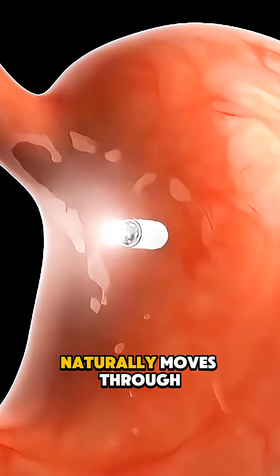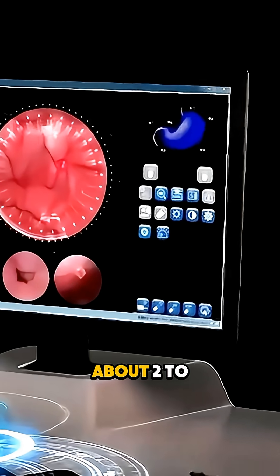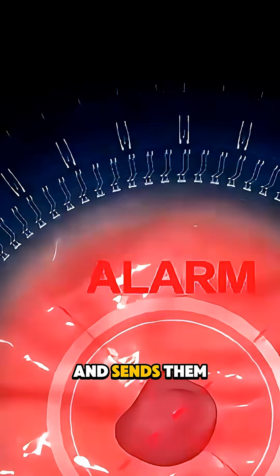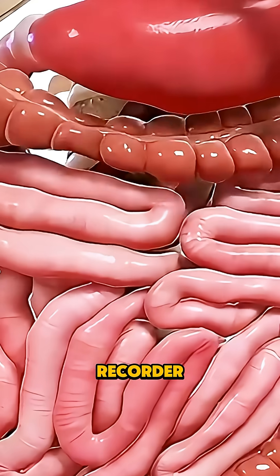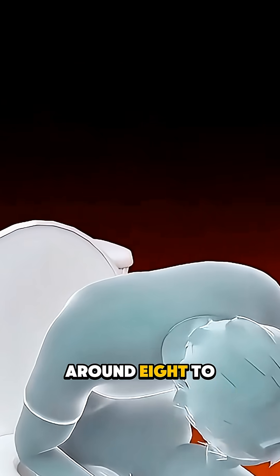As the capsule naturally moves through your digestive tract, it captures thousands of images — about 2 to 4 per second — and sends them wirelessly to a recorder worn on a belt around your waist. The journey takes around 8 to 12 hours.